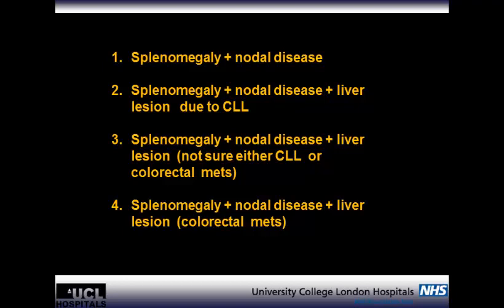Yes, I would agree that it is basically between these two. But if you look at the activity, the evidence behind the liver met is the intensity, and they confirmed it by doing the biopsy, because the SUV at this area was about 9.